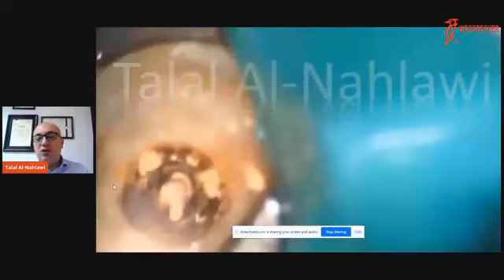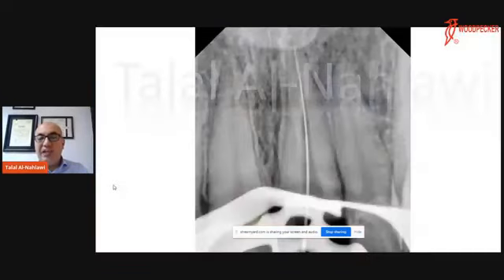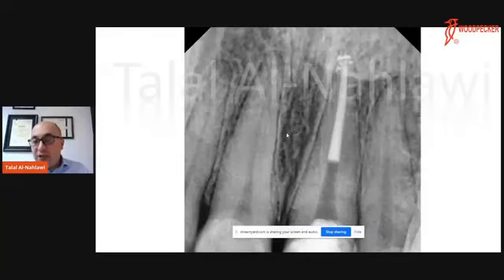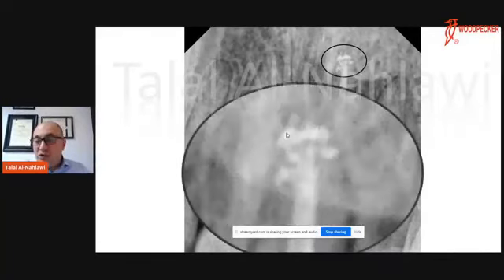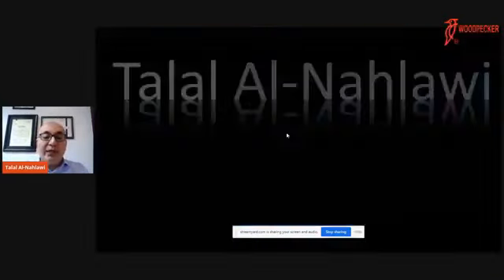For the remaining part you can also use the solvent, and you penetrate it and go further step by step in order to remove all the obturation material. And please note how conservative we were in the removal of the casted post. We didn't remove too much tooth structure, and this is the obturation with so many portals of exit. After obturation, this case was obturated partially.